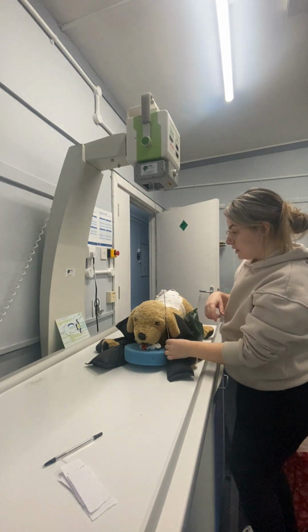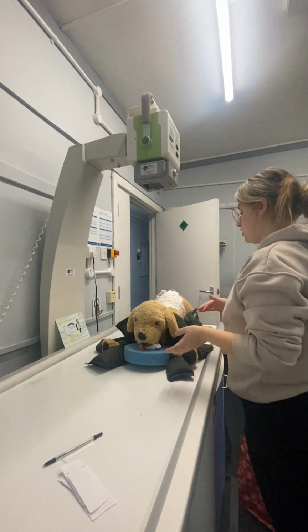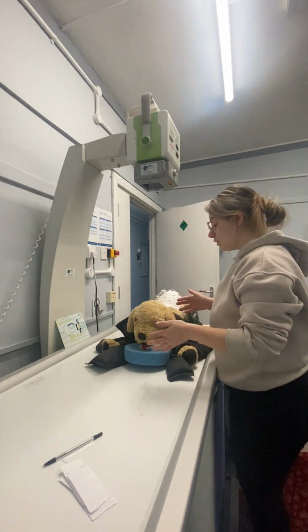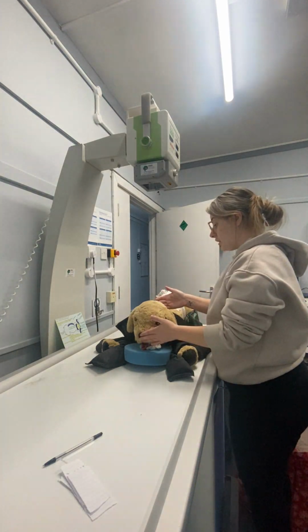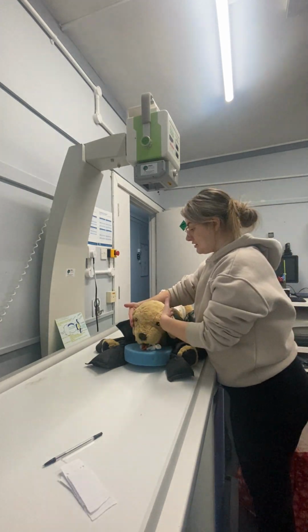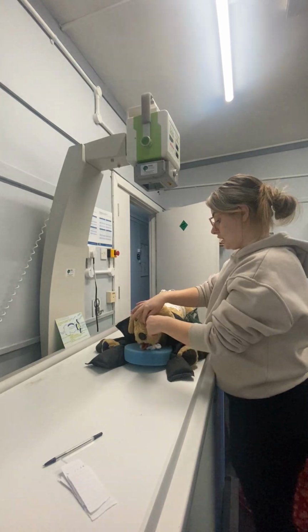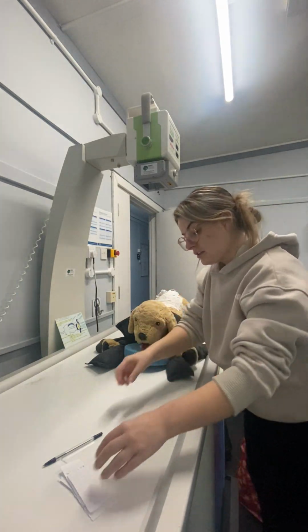So this patient is above 10 centimetres, so for this I would use a grid. And for this size patient I would use a medium sized cassette as well. So with my collimation, I'm going to collimate rostral to the nares, and then caudally to the atlas or caudal skull, and then lateral to the skin edges. And then I'm going to centre just between the eyes, just on the midline here. So that's my collimation centering.